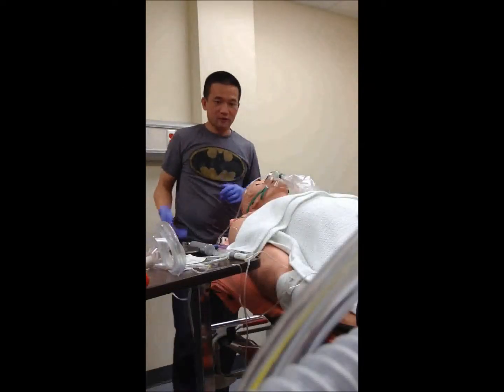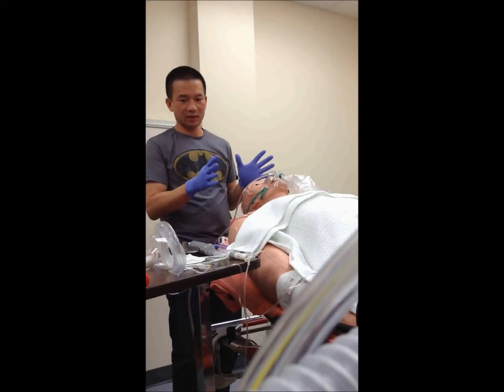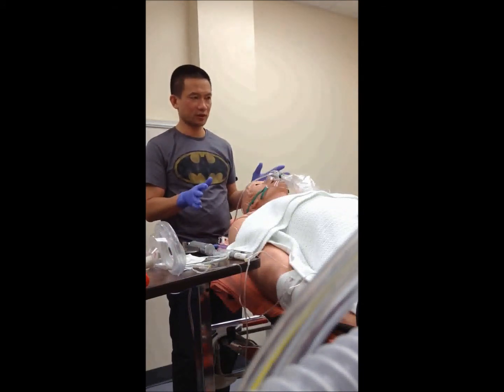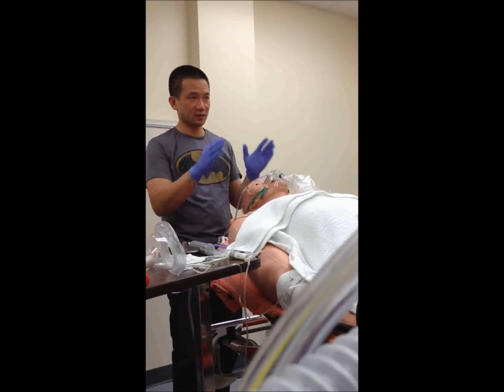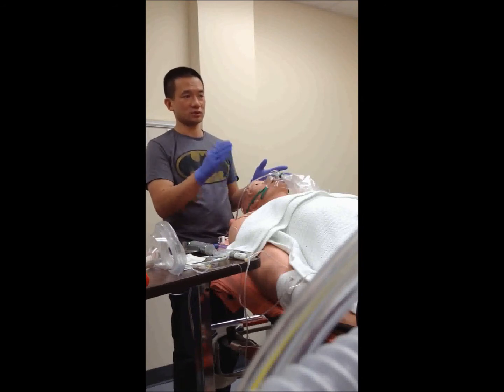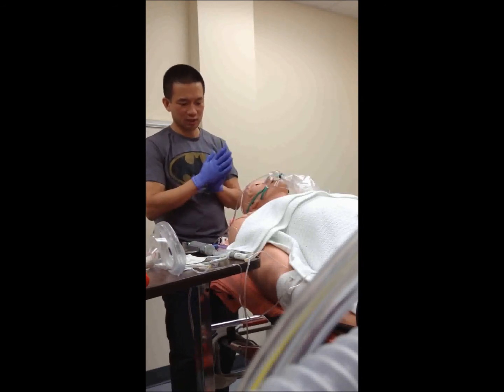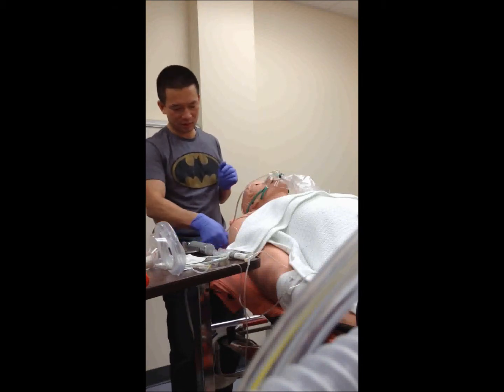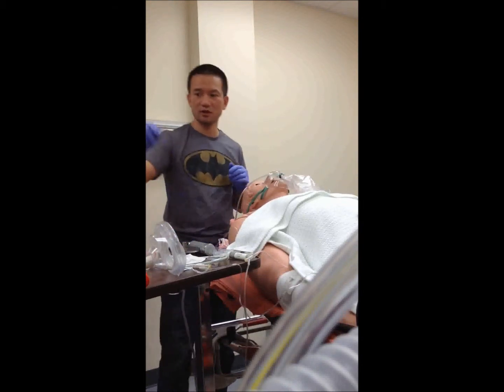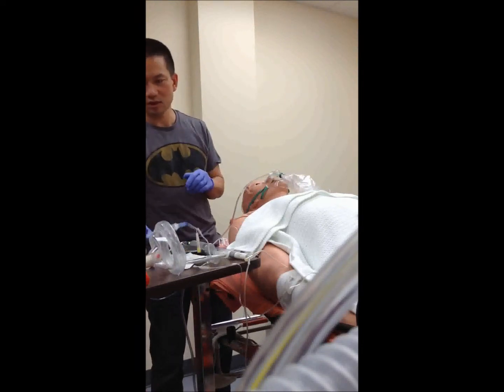Okay, so we're all set up and ready to do RSI. We're just going to go over a checklist to make sure we haven't forgotten anything. Patient is stable — vital signs are good, blood pressure, sats, everything's fine. So our checklist: STOIC BARS. S — suctioned, you've got superglottic airway, we've got a syringe ready.